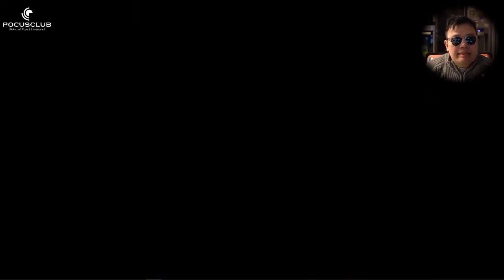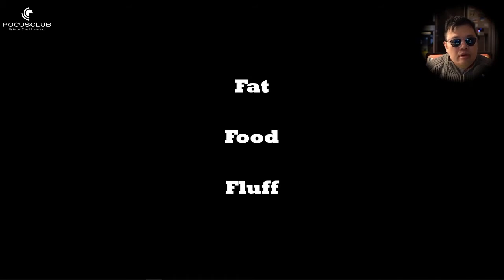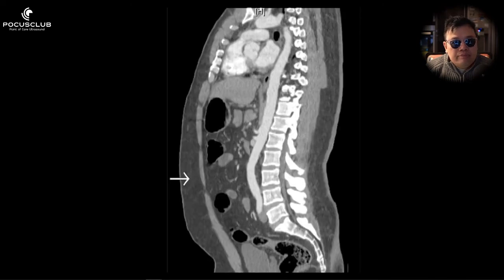The reality of the situation is that adipose tissue, food, body hair, and biogas all get in the way of ultrasound. Have a look at this CT slice. You can see that the aorta comes really close to the anterior abdominal wall. It follows the lumbar lordosis.